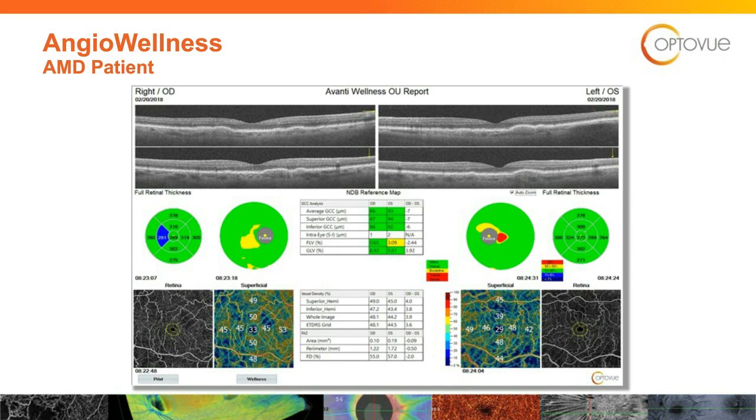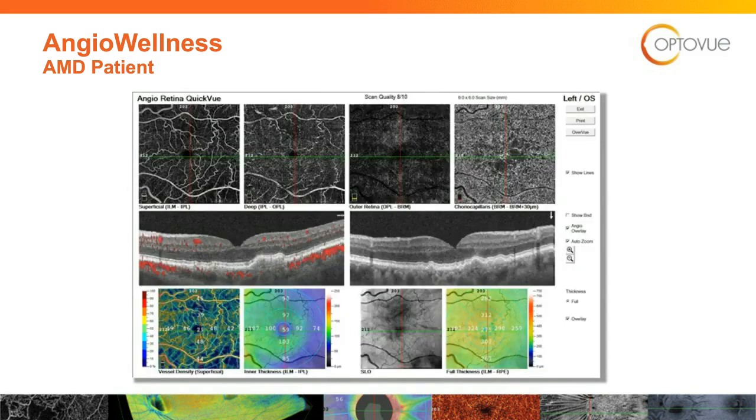We go to the individual B scan, and if you look at this middle scan here below the superficial and deep, where those drusenoid changes are, you can see that there's no blood flow activity, so there's really no activity down there. Again, it's a little bit more higher advanced, getting to learn how to interpret them. A lot of great webinars out there by my colleagues. I would encourage you to take a look at those.